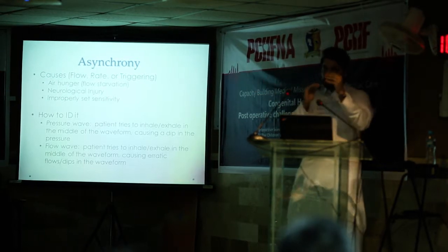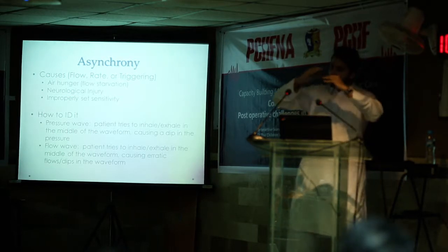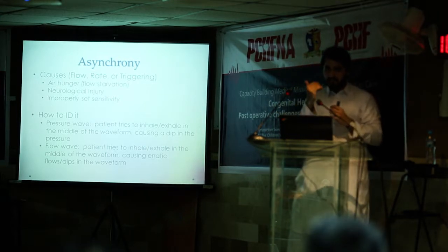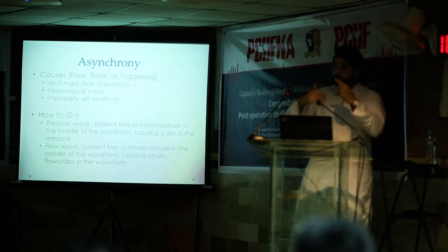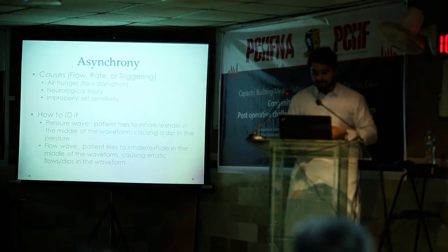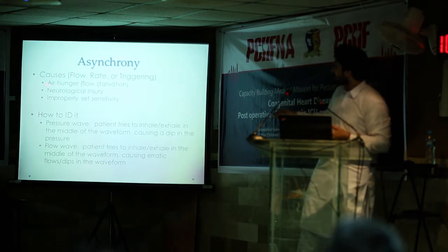In these 14, he is trying to get another breath above the breath. So he will not get this breath, and he will not get this breath. So now his breath became 13. So his minute volume will come down, and he may end up with increased CO2. So some of the causes of asynchrony is air hunger.